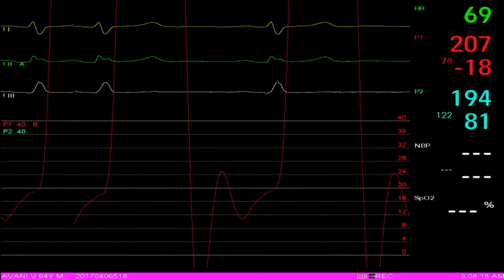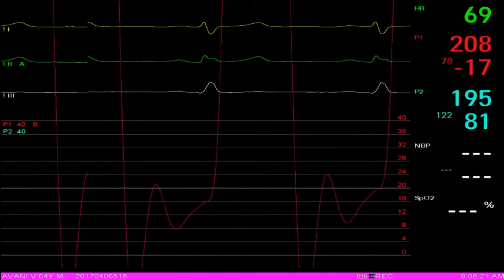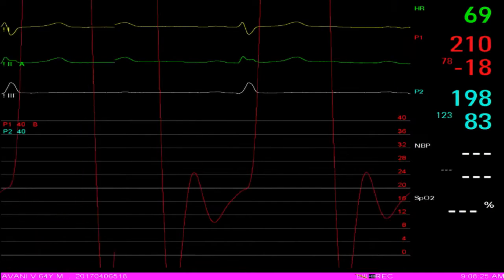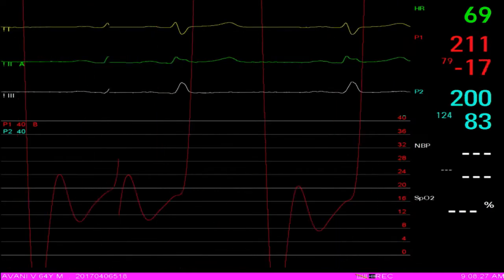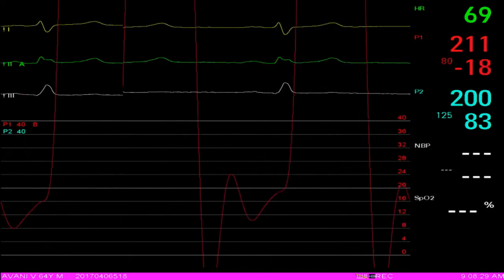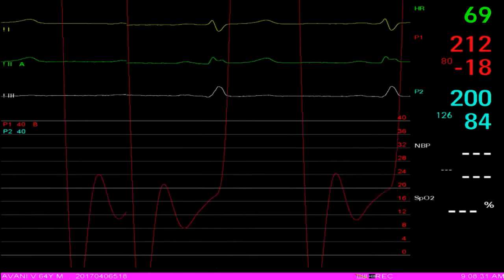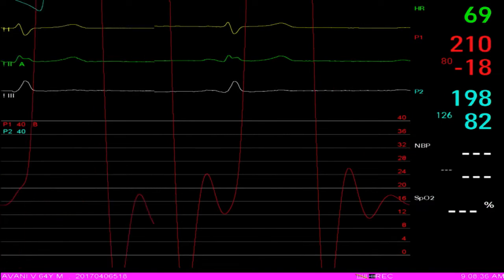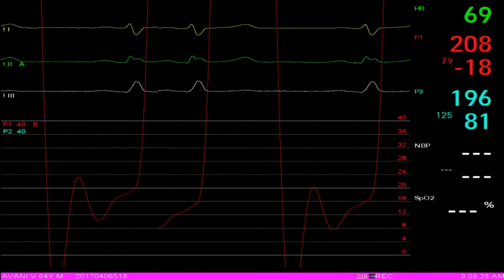You also observe that he's quite systemic hypertensive. See, he's conscious, and I'm doing this live demonstration, so he is listening. So obviously there is going to be a little bit of anxiety. Sister, can you give me one dose of Lasix, about 40 milligram intravenous? Sir, relax, okay? Everything is going on well. The hole is getting closed. Nothing to worry. Be cool.